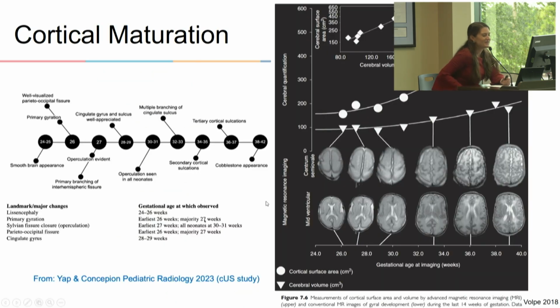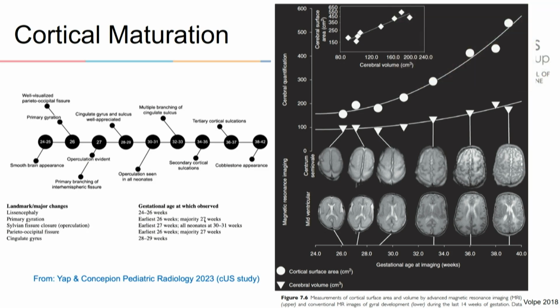All right. So this is a busy slide, but I like to show it because I think that it gives a great overview of how much brain development is happening in the third trimester. And if you think about it, a lot of our preemie babies are spending what would be the third trimester in the NICU, which is a very different environment than the uterus. So here on the right, you have MRI images.